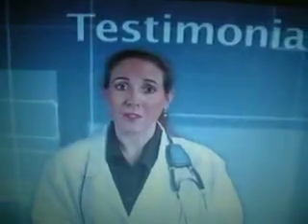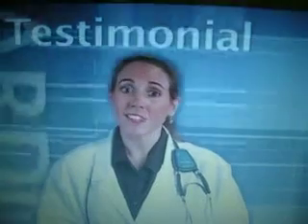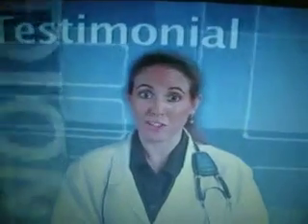So far, we've heard from 2 teaching physicians about the value that CardioSim brings to the classroom and patient teaching environments. Let's listen to a third testimonial from another CardioSim user.